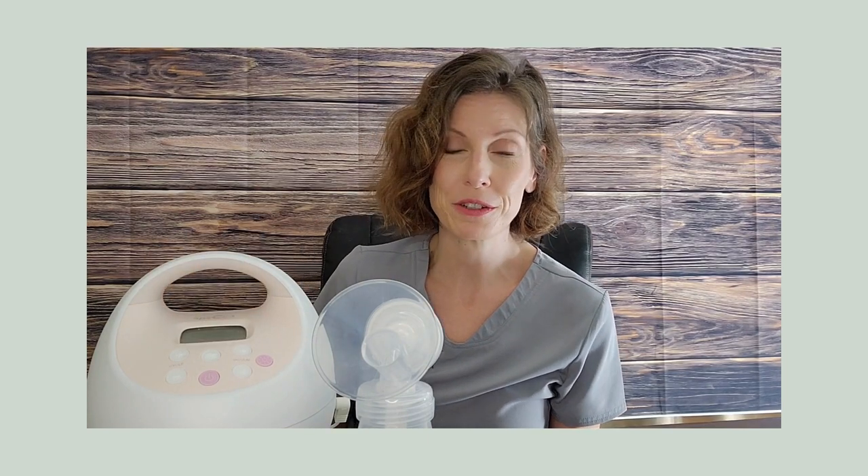That is our basics tour of the Spectra S1 and S2 pump. Hope you found this helpful and educational. As always, please reach out to me — DM me or send me an email at tracy@teapotlactation.com — if you have more questions about how to make the best use of your Spectra pump.